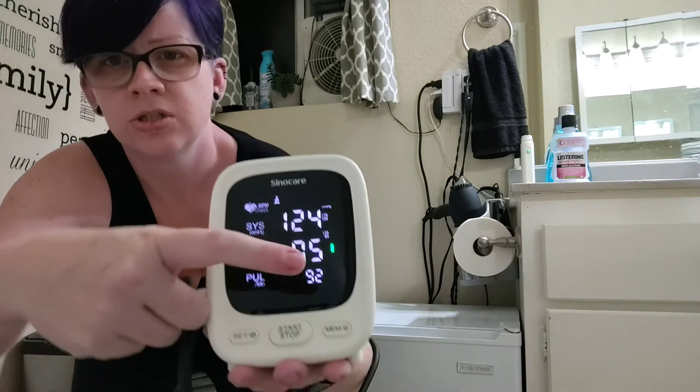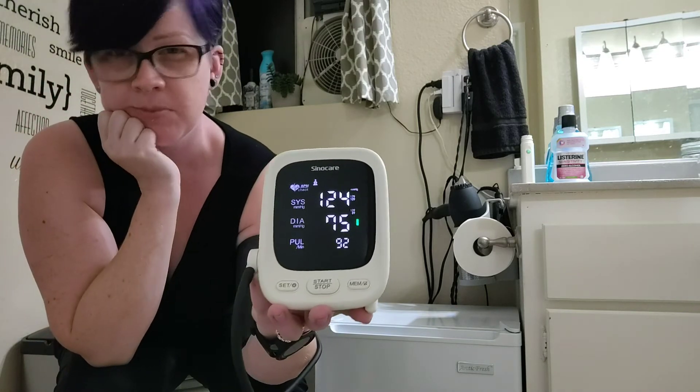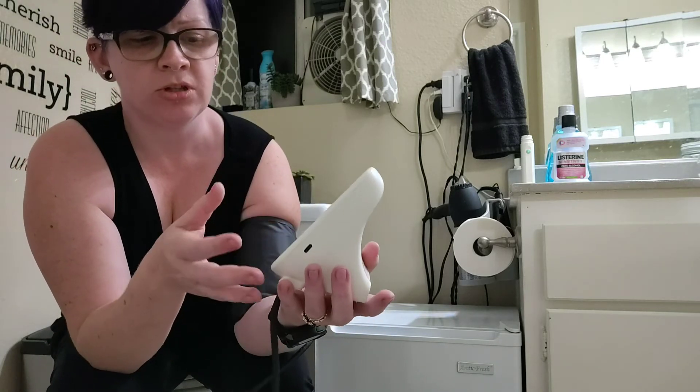You can see there's a little green light because that's a normal reading. If it's too high, it will show a red light so you know it's abnormal, in case you're not very familiar with where the numbers should be for you.